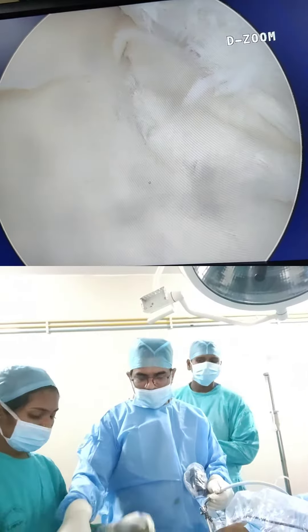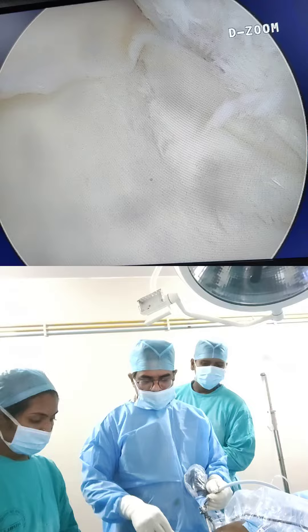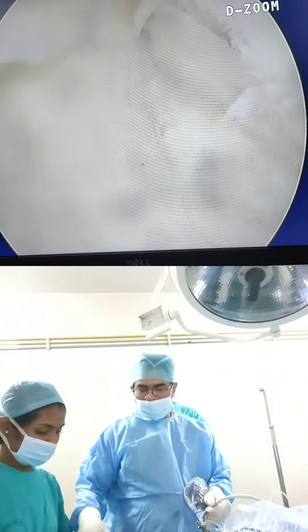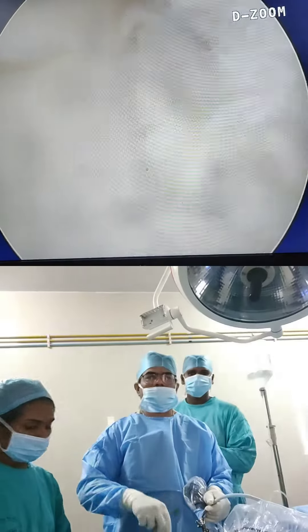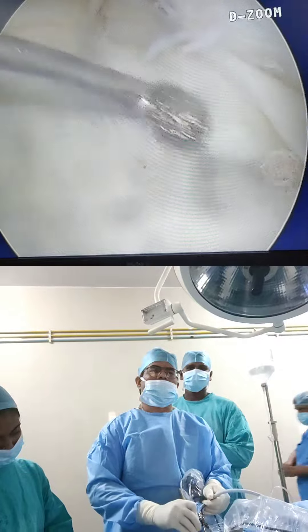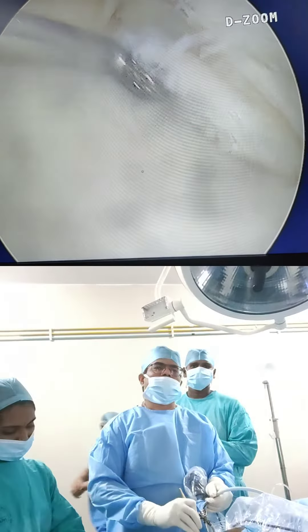So this is a classical rasp. We use a special diamond rasp. We shave this end — so this is a diamond rasp. We are shaving the ends of the tear to prepare them.